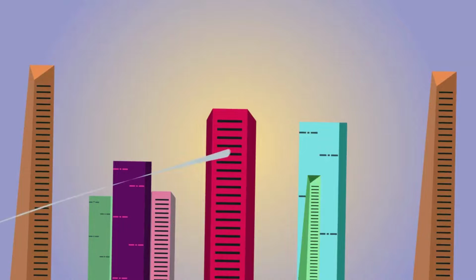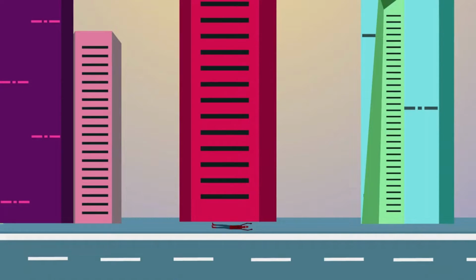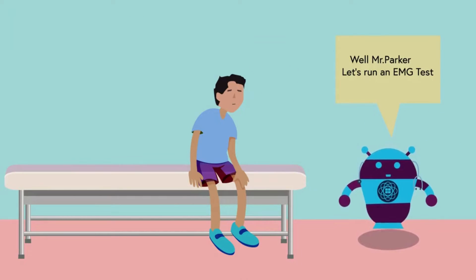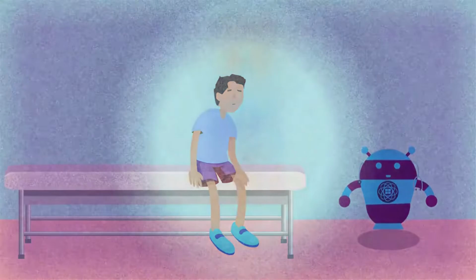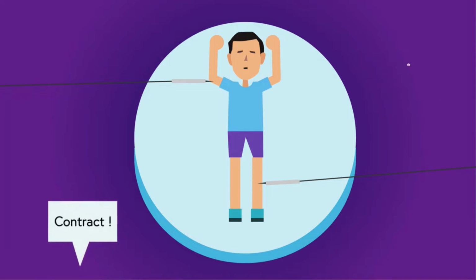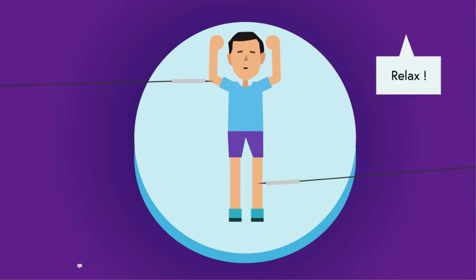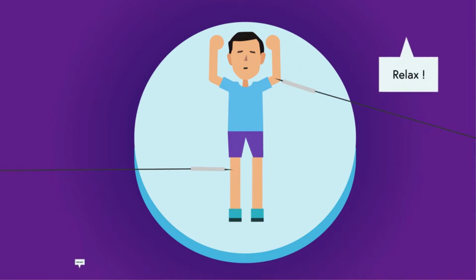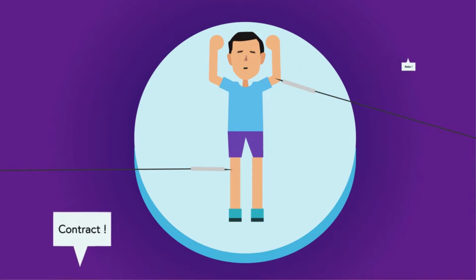Picture the following scenario. You begin having sudden muscle weakness in your extremities, which persists for a few months. So, you decide to go see the doctor, who wishes to perform an EMG test on you. He sends you to a special room where you lie flat on the table and have a needle electrode inserted into you. The technician operating the test requests you periodically contract and relax the muscles around the area where the needle is inserted, allowing the EMG to record the electrical activity of the muscle when it is resting and when it is contracting. This process is then repeated for all of your limbs, allowing your doctor to get a better look at what exactly is going on with you.